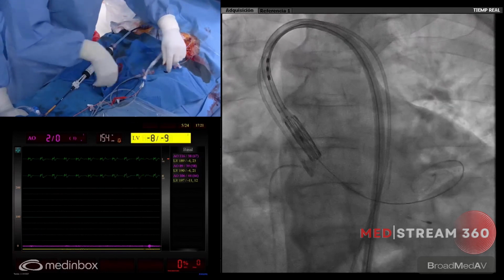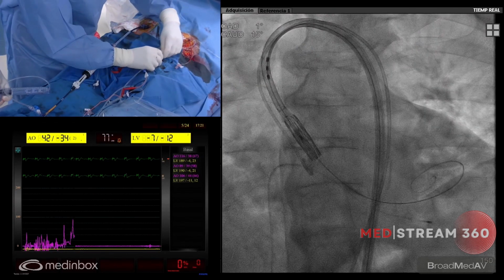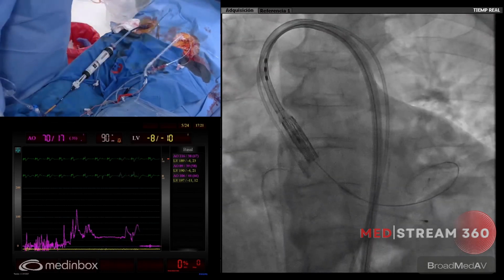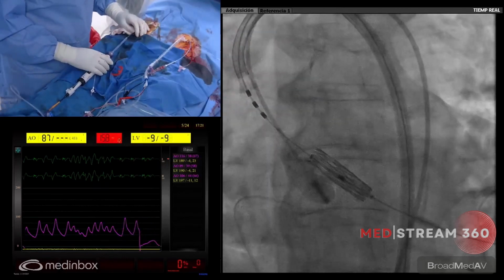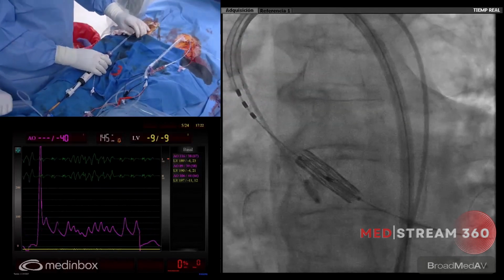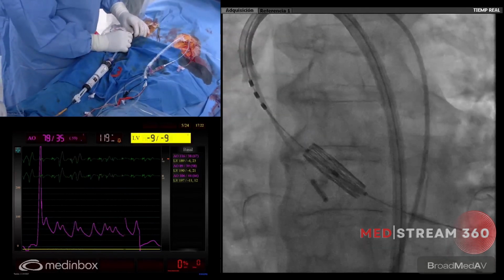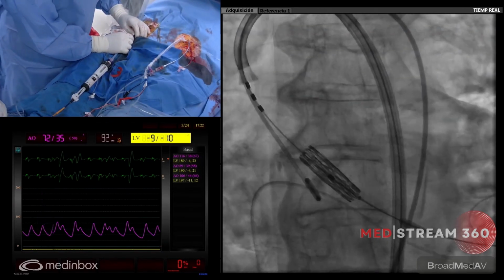So now they are not twisted. The pigtail is in the right position. And I have to go a little bit deeper with the valve. Will you test? Okay, throw a little bit higher. Do you agree? But not too much. Let's go with Cine. Cine.